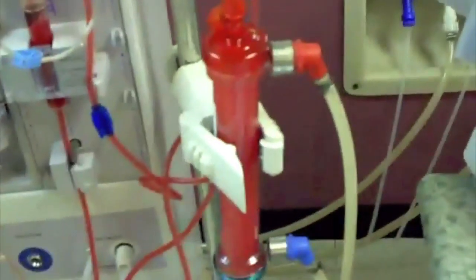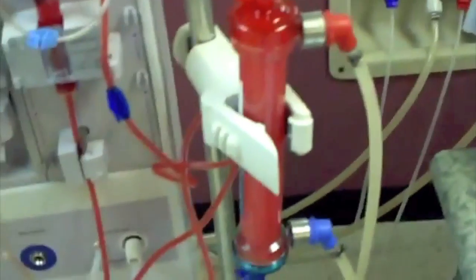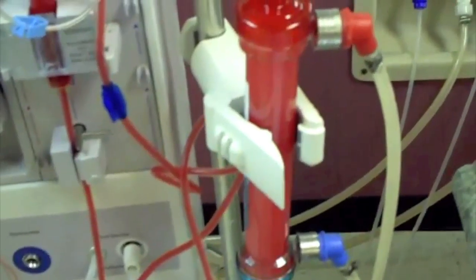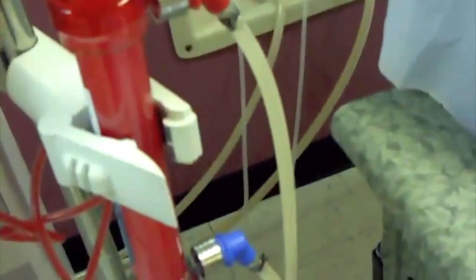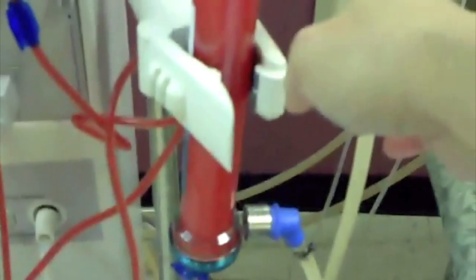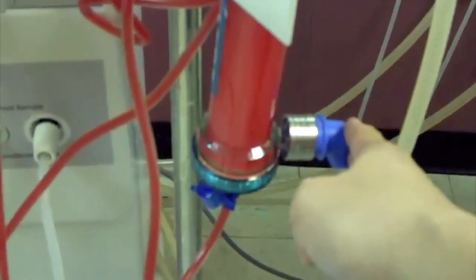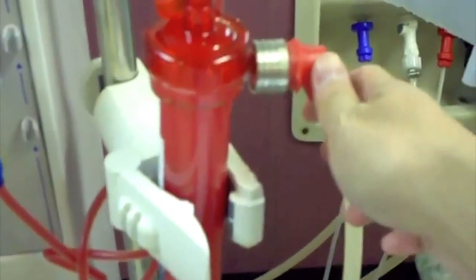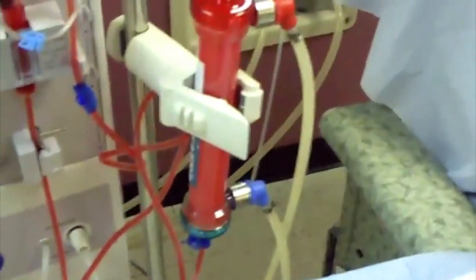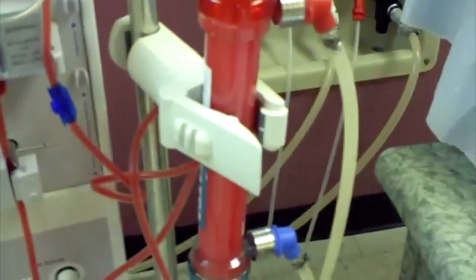The dialyzer has a countercurrent flow, meaning that on the blood compartment, the blood flows from the top going to the bottom. And on the dialysate side, the dialysate flows from the bottom going to the top, creating a counterflow. So, in other words, the blue on the dialyzer is going in, going up, and this is the red, that's where it comes out. When it comes out, it goes back inside the machine and it will be filtered out through the drain in the back of the machine.